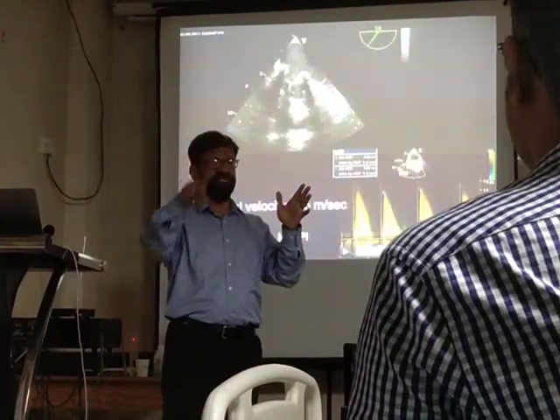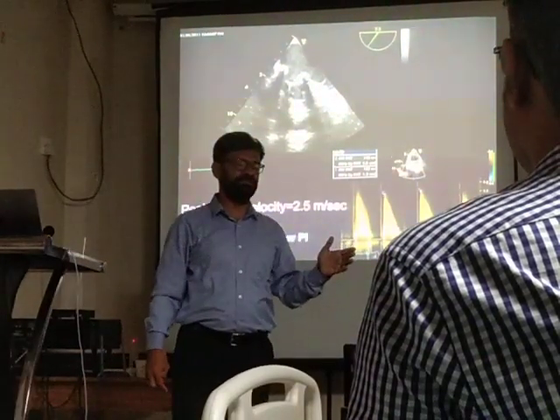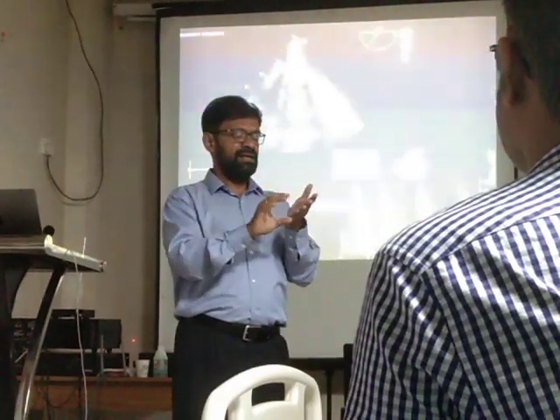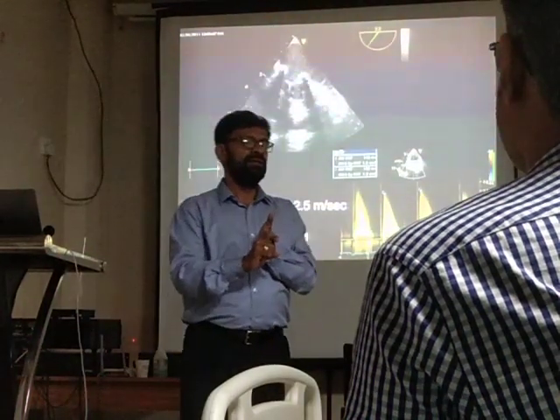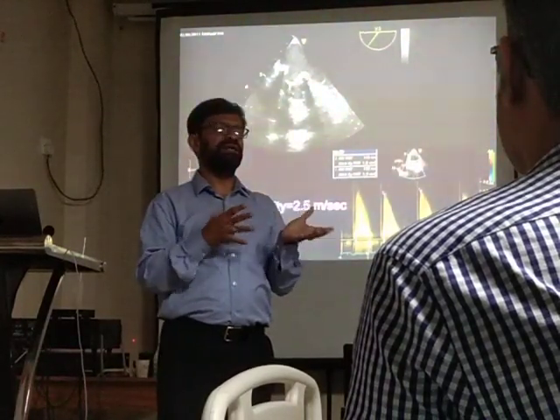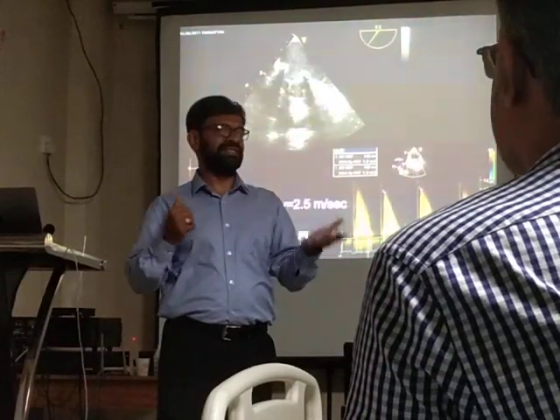Whatever prosthetic valve you get, across the gradient, always give peak and mean. Trace correctly. So, on discharge, from a surgeon's perspective, you should have the prosthesis type, what is the opening angle, and what are the gradients at rest. Mitral valve gradients are generally lower than aortic valve prosthesis. Mitral valve gradients are roughly around 10 by 3, 11 by 7.